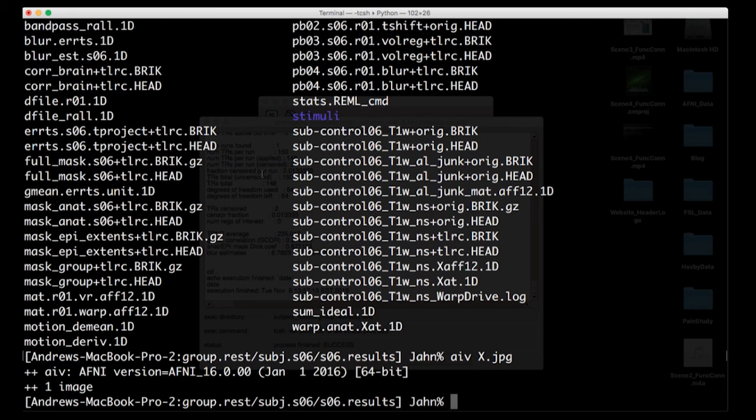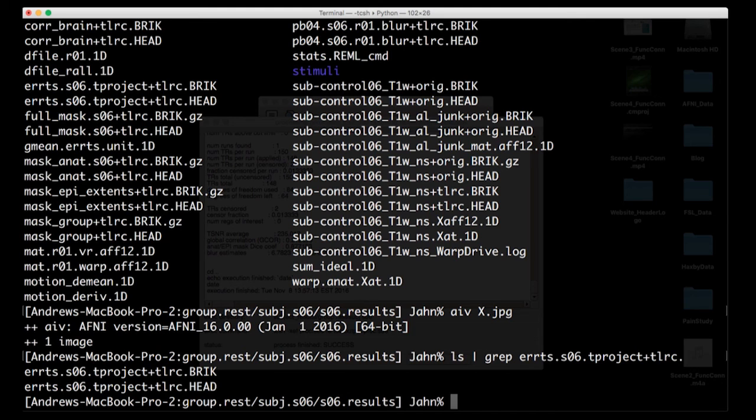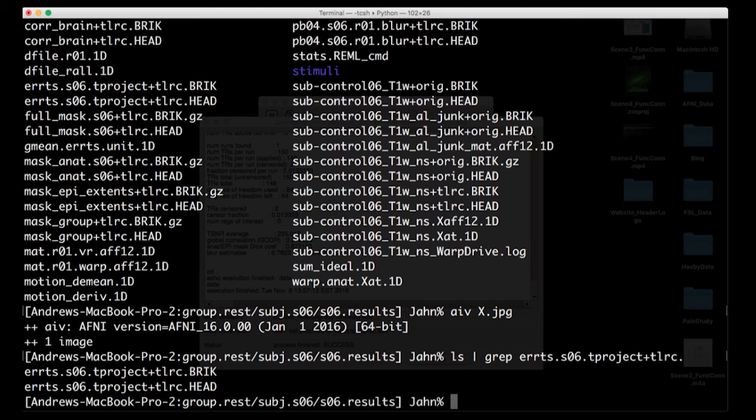Now, also notice that there's something called an error time series. If you've used this with a task related data set, the error time series is everything that cannot be explained by your model. And usually you don't worry too much about it. But in the case of resting state analysis, everything that we put into our model is stuff that we want to remove from it, right? So things like the motion, things like the frequencies, things like the slow scanner drift with the polynomials, we're going to project that out of our data. There's another command in there called 3dTproject during the pre-processing, which is going to de-trend all that stuff out of your data. Basically, it's just a way of scrubbing or cleaning up your data to remove any sources of noise.